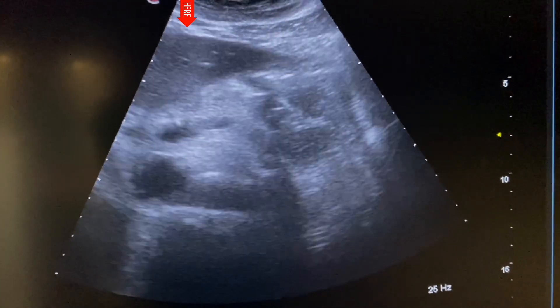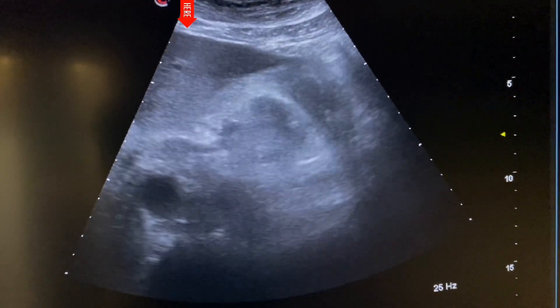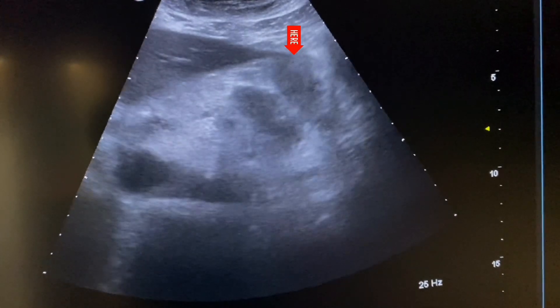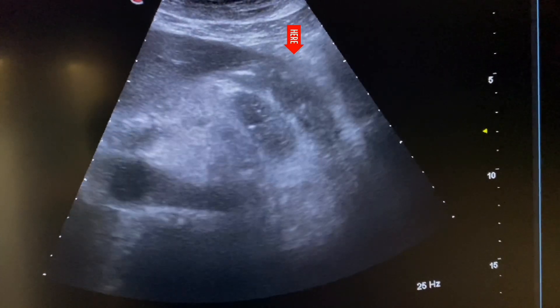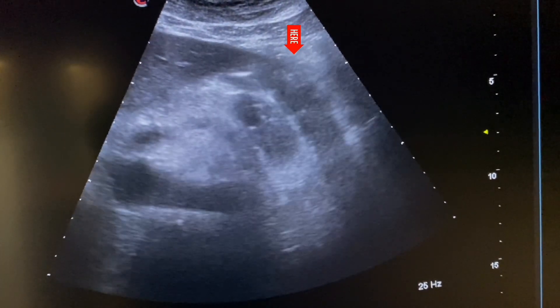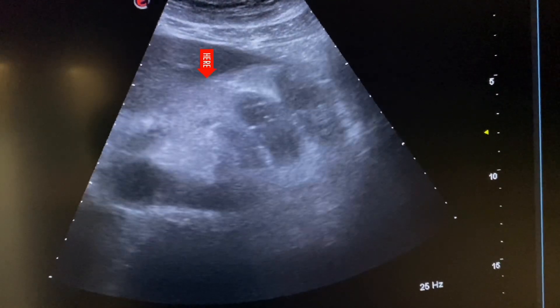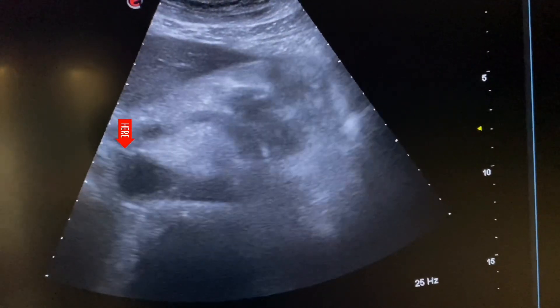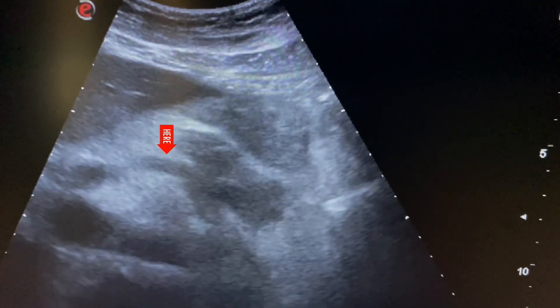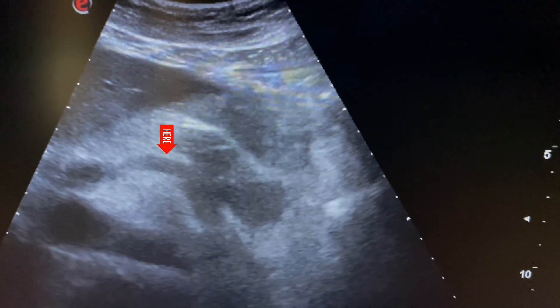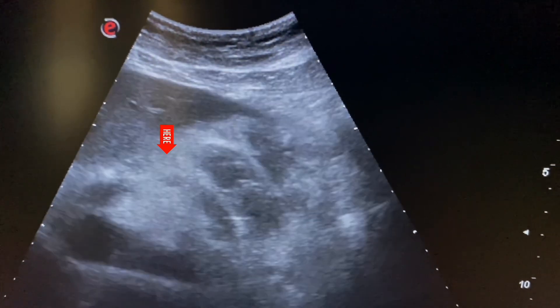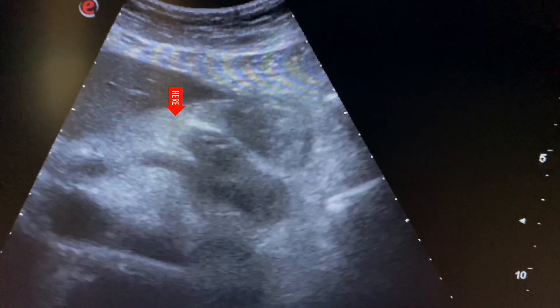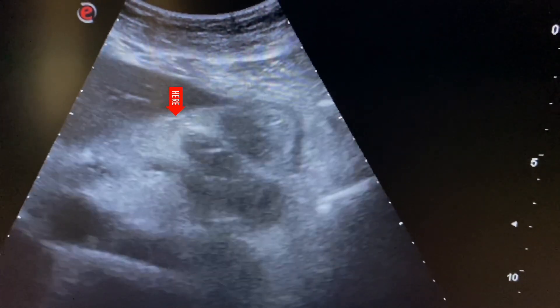We start scanning here. We see the left lobe of liver, this is duodenum, and this is pancreas. Here we see the splenic vein and IVC. The pancreas lies above the splenic vein.